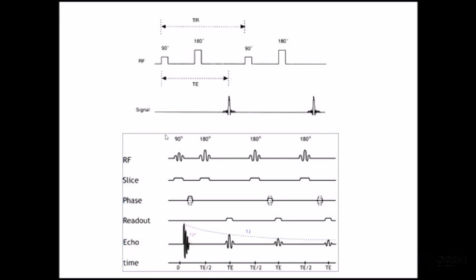Okay, so it chooses how close these pulses are played out. Now that's not something that we characteristically think about when we're scanning, but when you choose that 25 milliseconds, that then goes away and sends that instruction to how the RF is played out, and it's done for you.